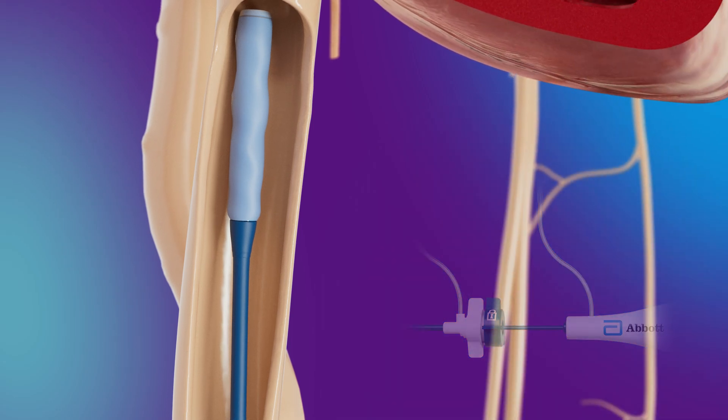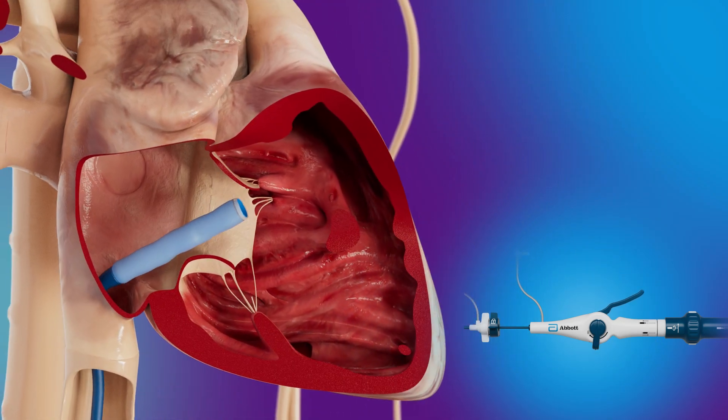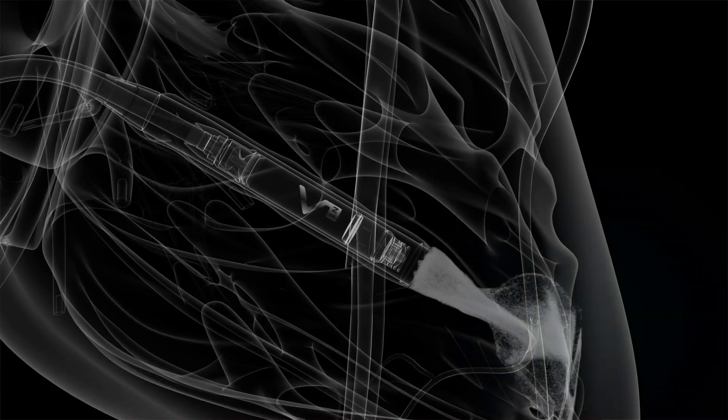The LP is interrogated using the Merlin PCS programmer and communication is established. The device is then advanced using fluoroscopic guidance to the mid-RV. A contrast injection is performed to allow proper visualization of the chamber and identification of a target location.